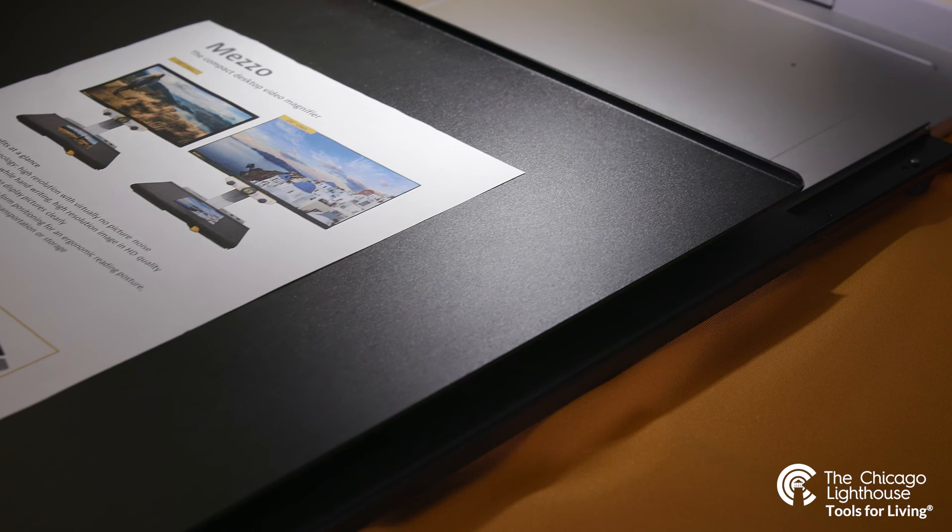The Mezzo has available sizes of a 20 inch screen and a 24 inch screen. Today we're going to be showing the standard 20 inch screen.